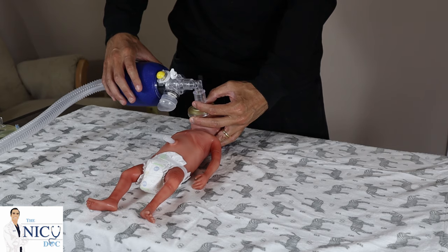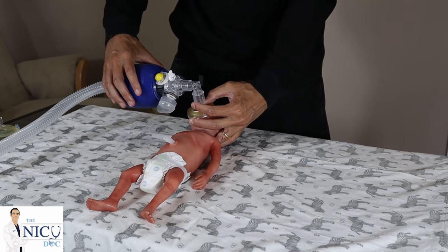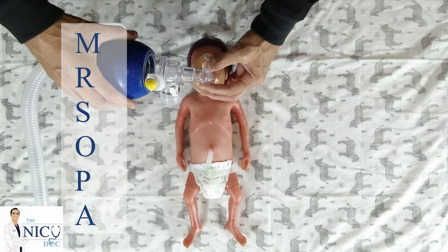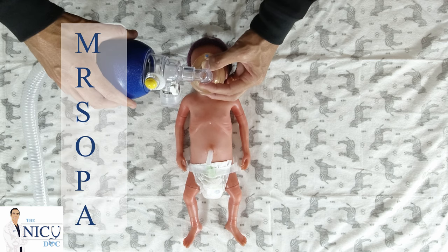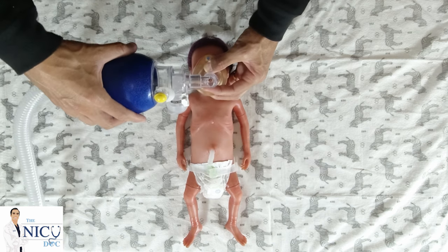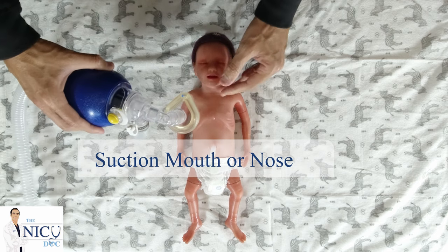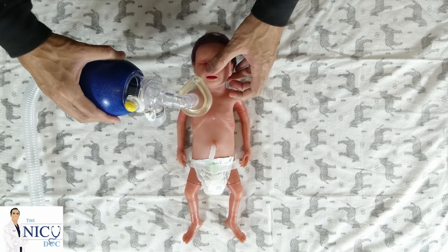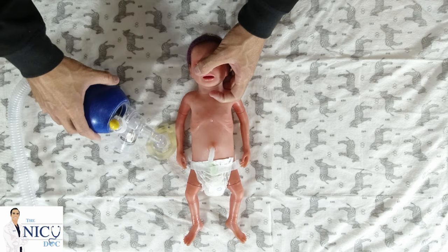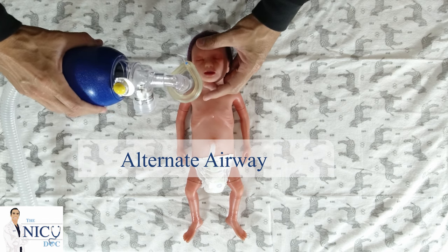If the vital signs are not improving, that means you have inadequate ventilation. You're not getting enough oxygen or not getting rid of the CO2. At this point you want to practice Mr. SOPA. Mr. SOPA is an acronym developed by the American Academy of Pediatrics and the Neonatal Resuscitation Program. It stands for: M — adjustment of mask; R — repositioning of airway; S — suctioning the mouth or nose; O — opening the mouth; P — adding more pressure; and A — alternate airway.